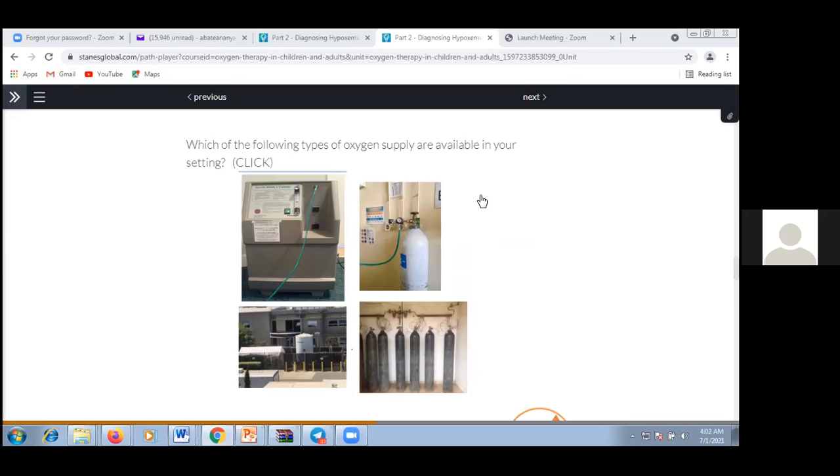So Dr. Unatu, can you tell us about your institution, your setup, what oxygen source you are using? Thank you, Dr. Ananya. The practice at St. Peter is also the same. So we use oxygen concentrators and oxygen cylinders. But a couple of months ago, we completed a central oxygen source. Soon it will come into practice so that we may use central oxygen, which may be distributed throughout the ICU or in some major areas. Otherwise, we use concentrators and cylinders.